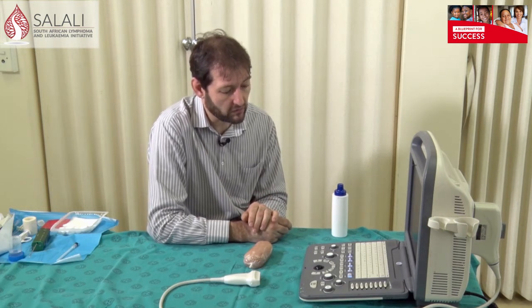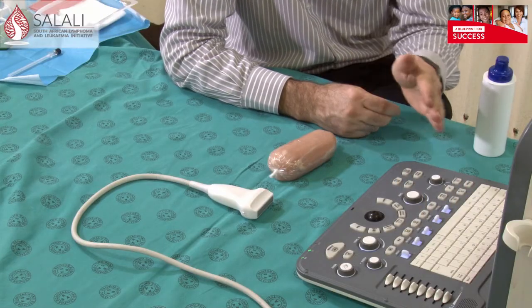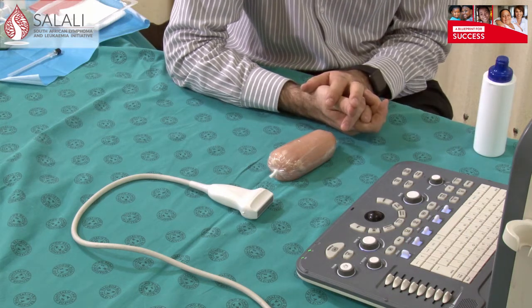If your machine has the capability, you can turn on the color Doppler flow, which will show you large blood vessels and blood flow around the area you're going to biopsy. This is particularly useful when biopsying large sarcomas, which often have a lot of necrotic material in the middle of the tumor. If you biopsy that material you're not going to have a good outcome — you need to biopsy the area with vascular flow to make sure you're getting tissue that is alive and not necrotic.